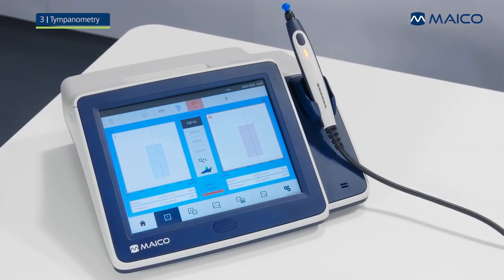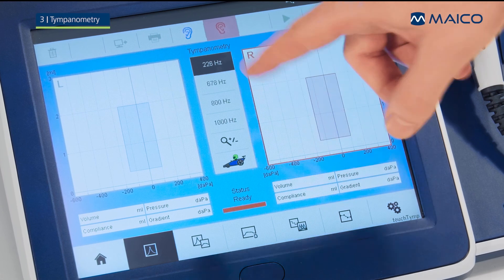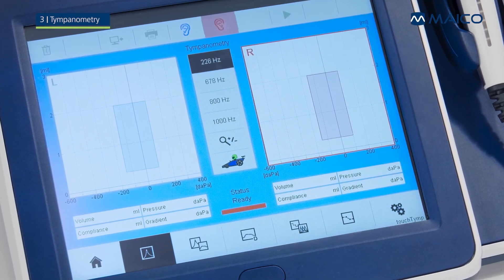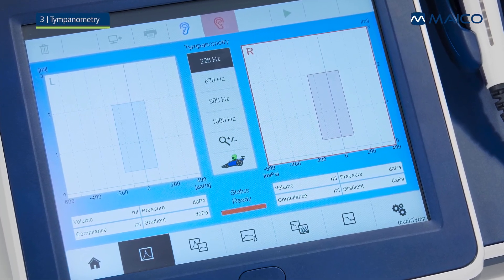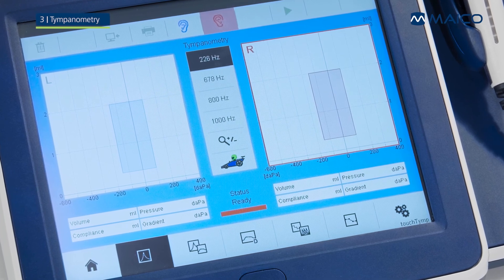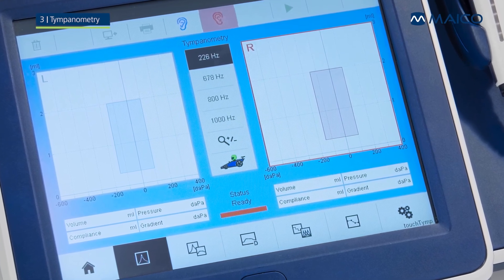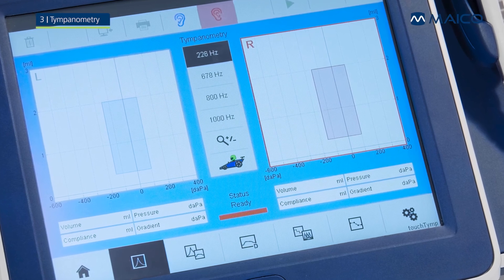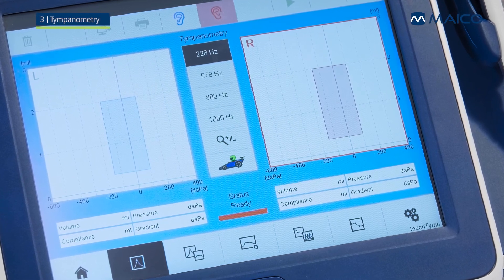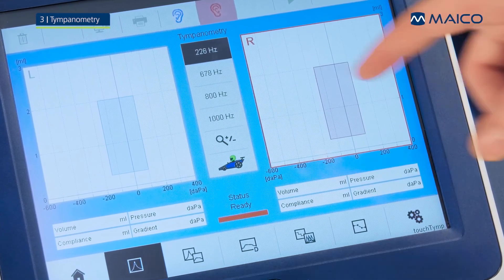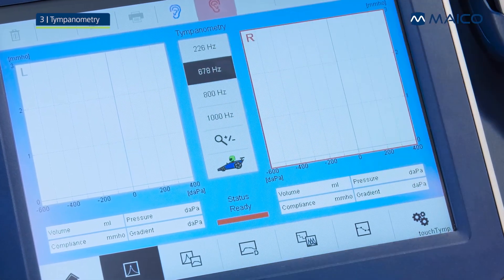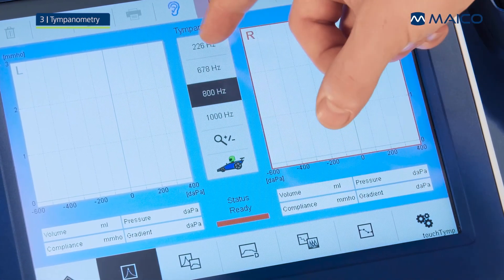A test frequency of 226 Hz is always pre-selected as default to quickly start a test. 226 Hz testing is recommended for adults and children older than half a year. Depending on your device configuration and purchased license, you can choose a frequency of 1000 Hz, 678 Hz, or 800 Hz.